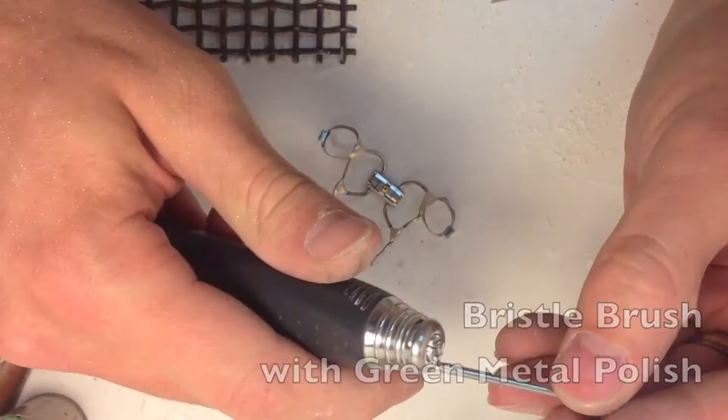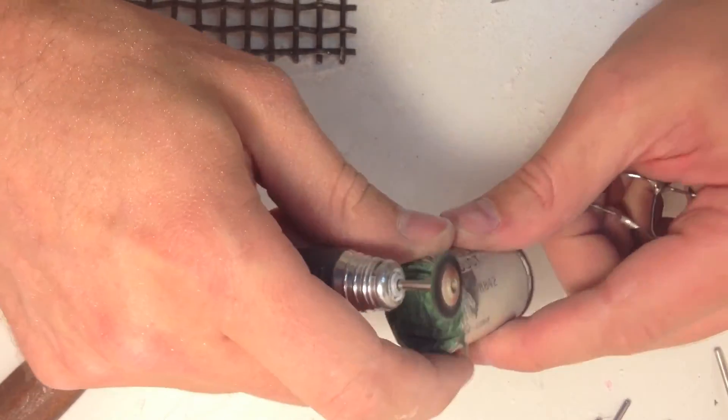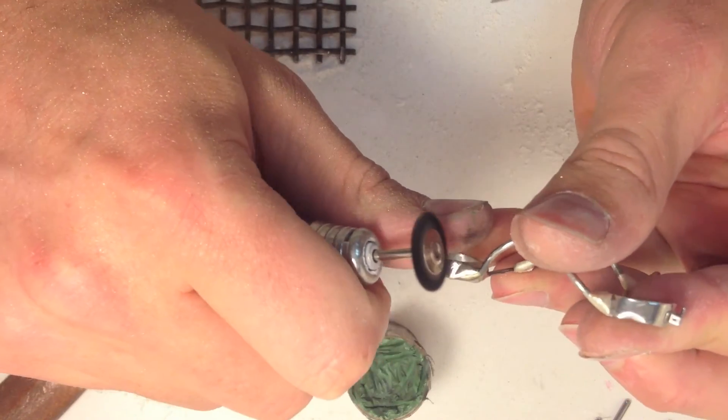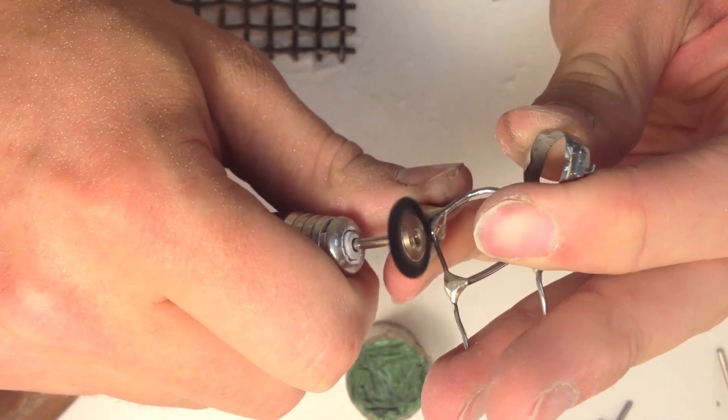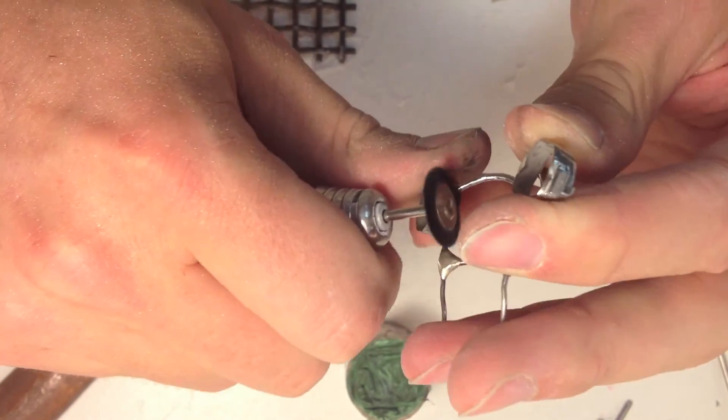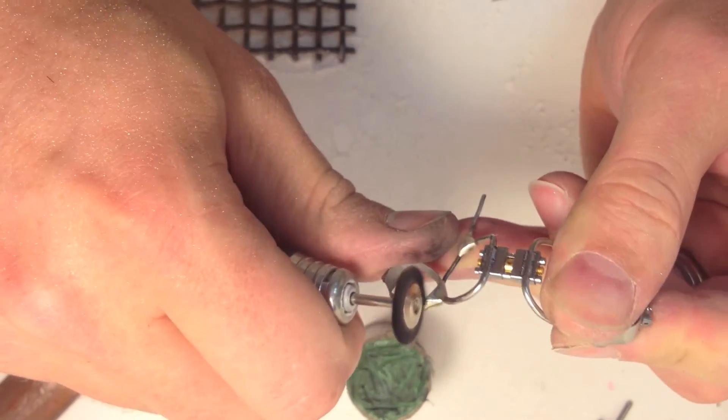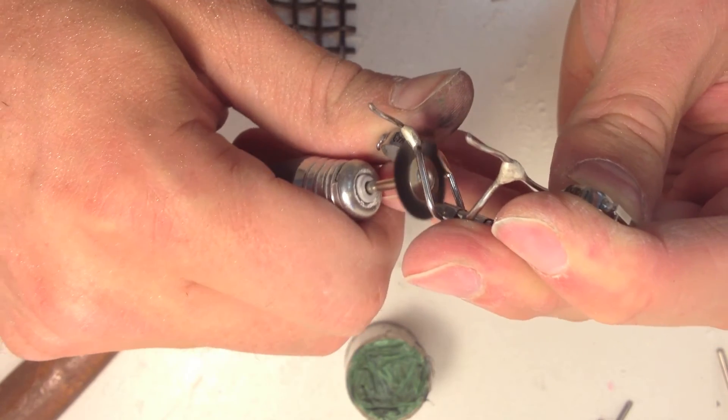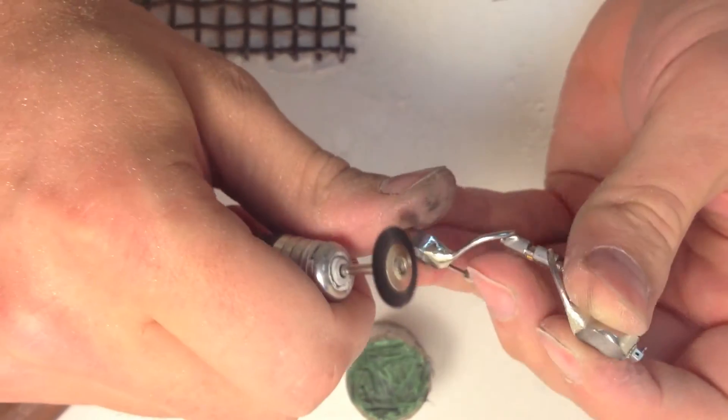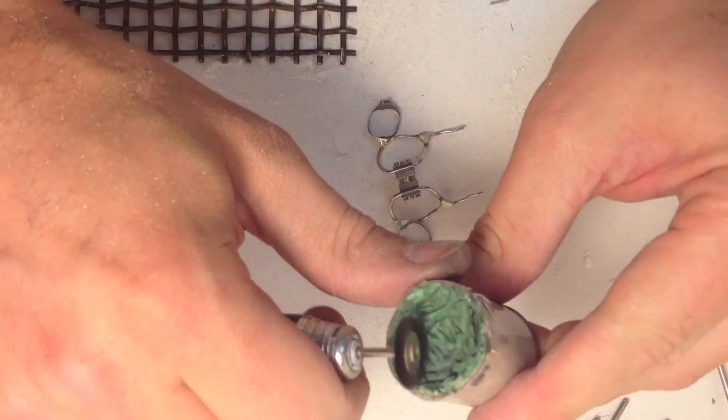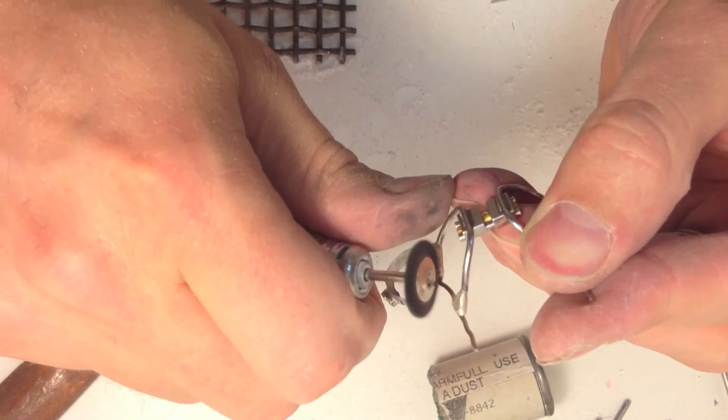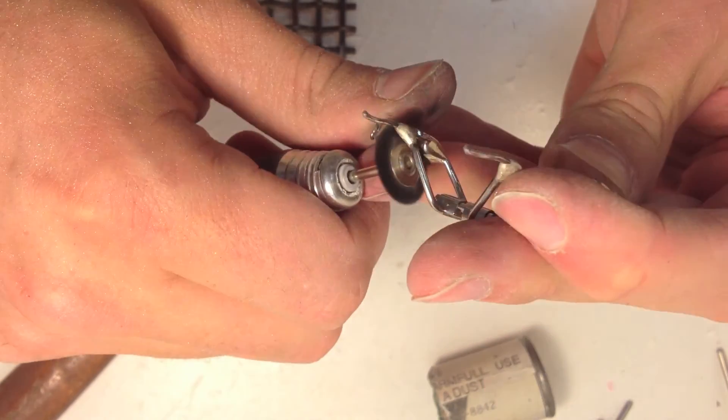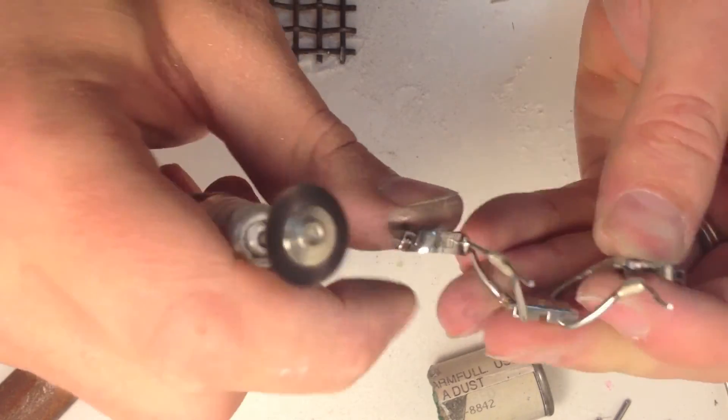This is just a bristle brush. You're going to load some metal polish on here and then just use this back and forth method. Go back and forth a few times. Oops, wrong side. This also shines up the rest of it.